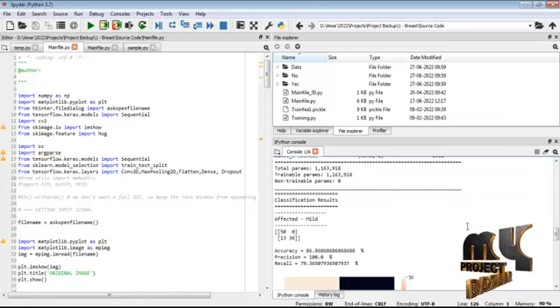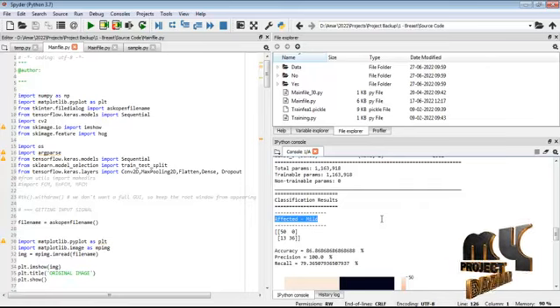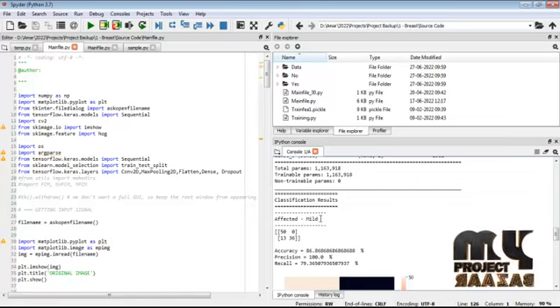In this classification step, we have to find out whether the input image is affected by any disease or not. If it is affected by a disease like a tumor, it has to detect the stage of the disease, whether it is the mild stage, moderate stage, or the severe stage. The image we gave as input is an affected image, but it is in the mild stage. So the predicted classification results will be shown like this.